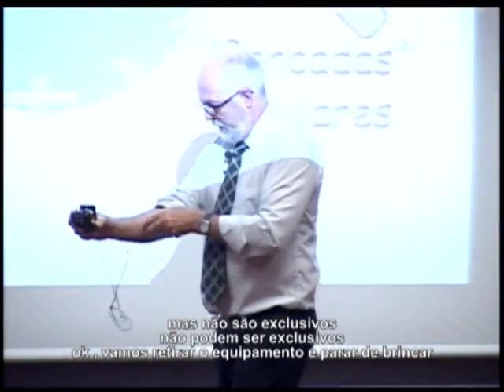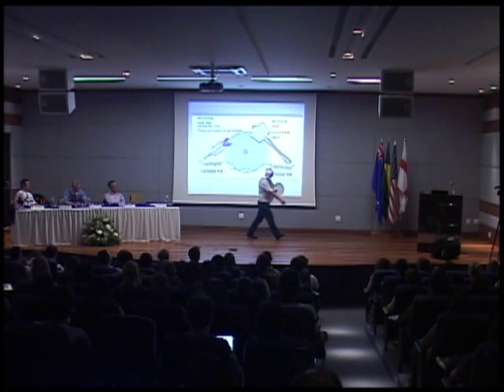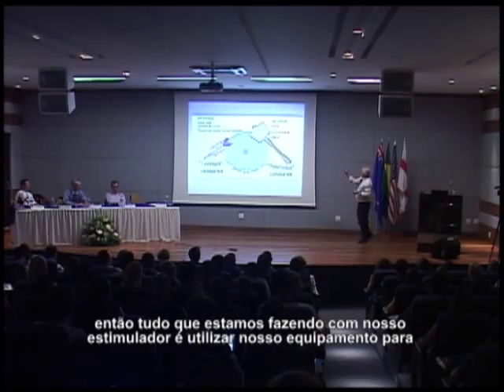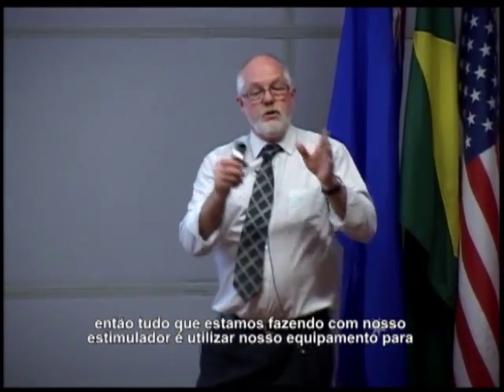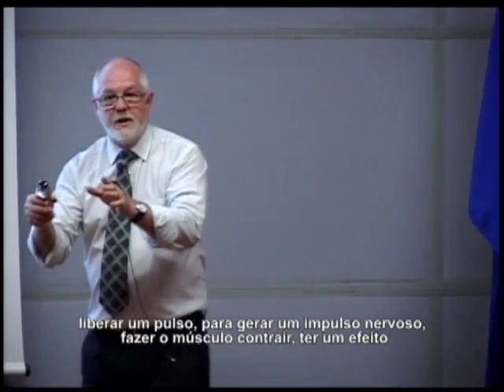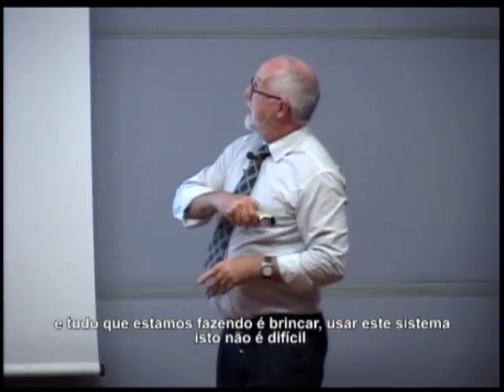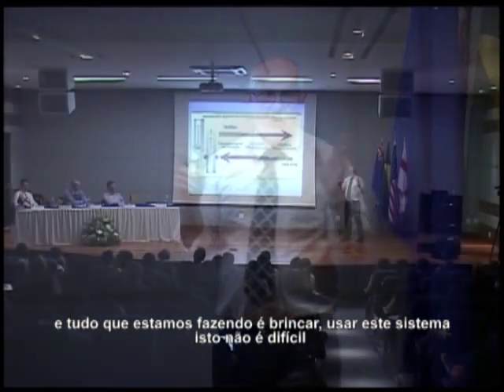Right, let's take the machine off and stop playing games. So, all we're doing with our stimulator is we are using a machine to deliver a pulse, to make the nerve fire, to make the muscle twitch, to have an effect. And all we're doing is we are using that system. It's not difficult.